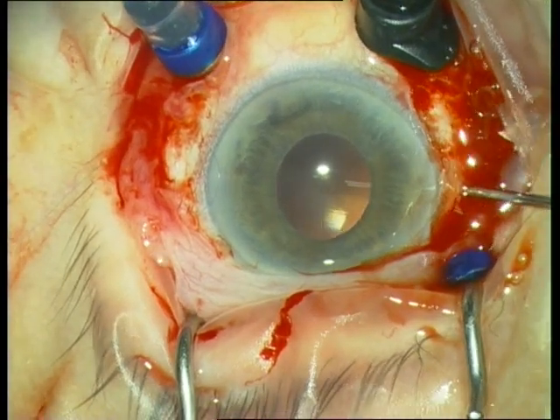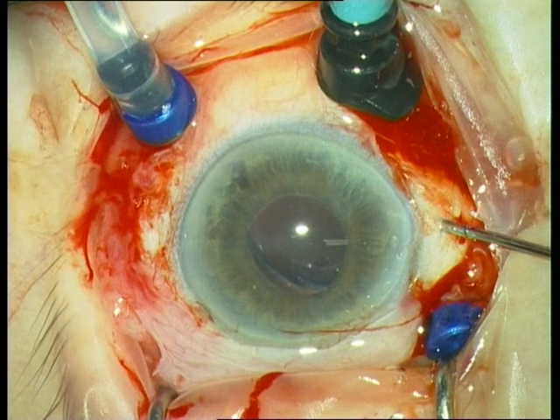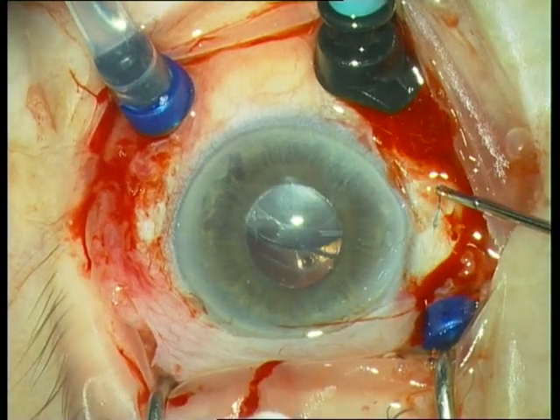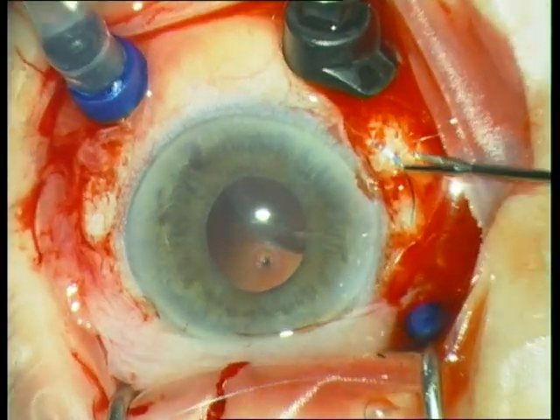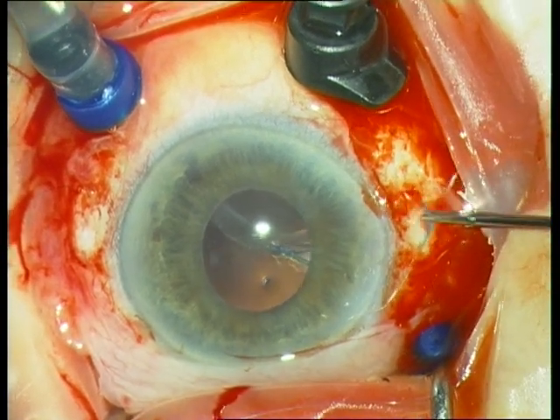The same procedure at 9 o'clock: insert the forceps at 9 o'clock, grab the haptic, draw it out, fixate the suture, and push the haptic back into the eye.